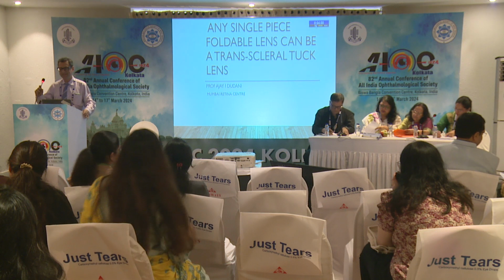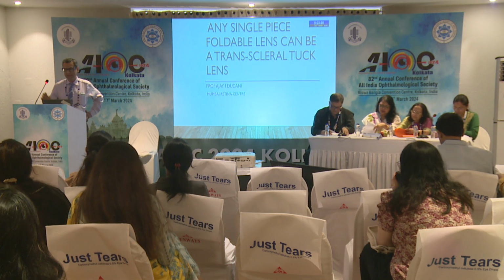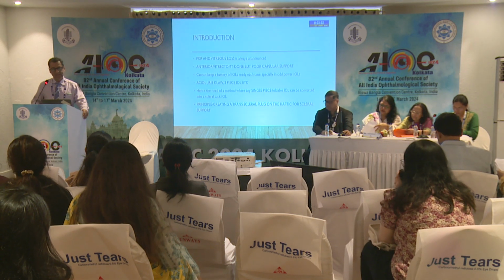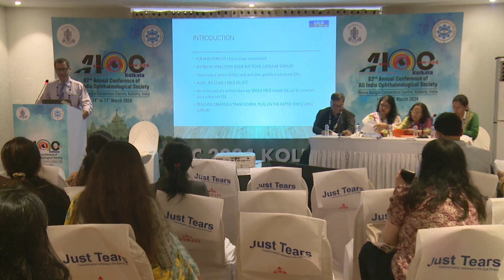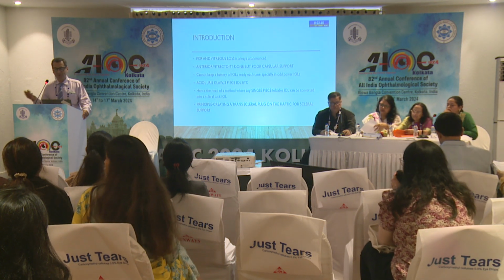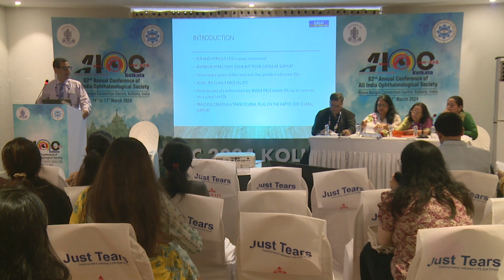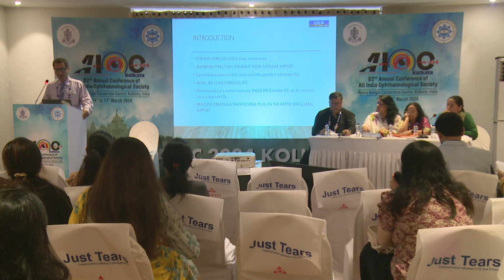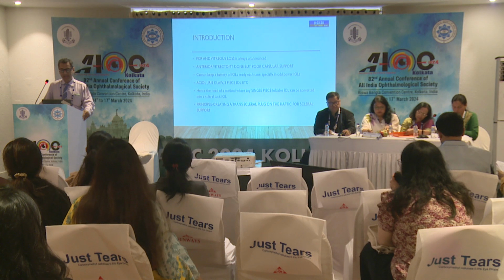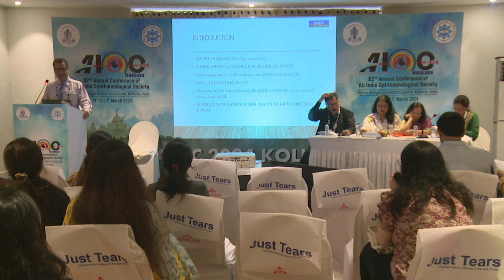So my topic, I'm Dr. Ajay Dudani, is that any single piece foldable lens can be converted into a transscleral tuck lens. PCR with vitreous loss always comes unannounced. Anterior vitrectomy is done, but if there's very poor posterior capsular support where you can't put the lens on the rhexis, you can't always keep a battery of IOLs ready as a follow-up, especially with odd power IOLs like AC IOL, iris claw, 3-piece. Hence the need for a method where any single piece IOL can be converted into a scleral tuck lens.